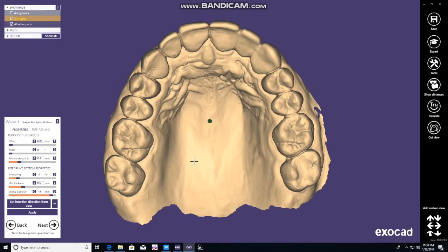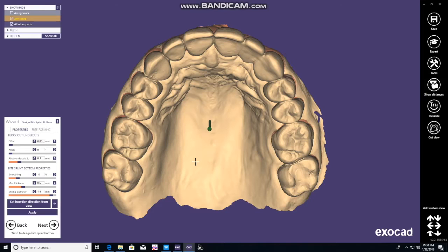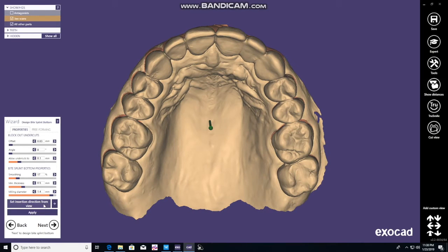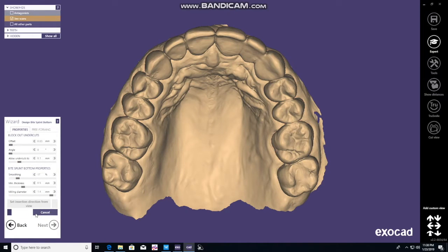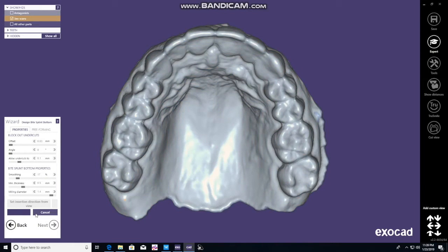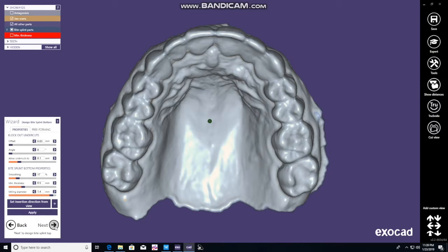This is going to confirm the path of insertion, blocking out any undercuts that you don't want based on your specifications. Here we decided to change the position, set it, and run the application. It'll make this gray model that is basically blocking out areas that you don't want the appliance to lock into — basically the undercuts. You'll see it'll be grayed out. Once you like that, click next.